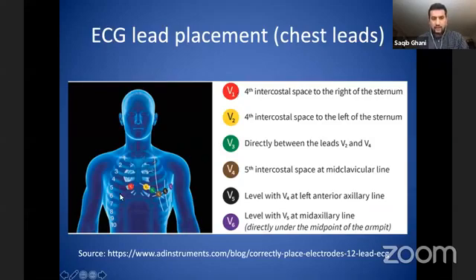So why is it important? क्योंकि if ये 3-dimensional picture अगर आप देखें, the heart is sitting behind the sternum and the ECG leads are on the chest. So ये chest fold की ECG leads बता रहा हूँ मैं आपको. This is like looking at something from a 3-dimensional perspective. ठीक है, तो imagine these are 6 cameras looking at the heart from different angle. अगर आप कैमरे को गलत एंगल पे लगा देंगे तो it will look at the wrong part of the heart. So you will get an ECG which will look abnormal by mistake. So that's why it's important to know. और maybe part 1 questions जो होते हैं उनमें ये सवाल आता है where to put the ECG.